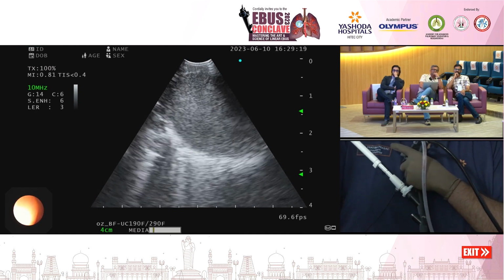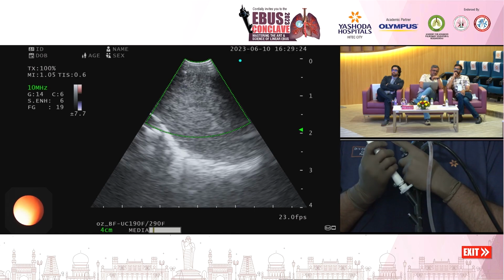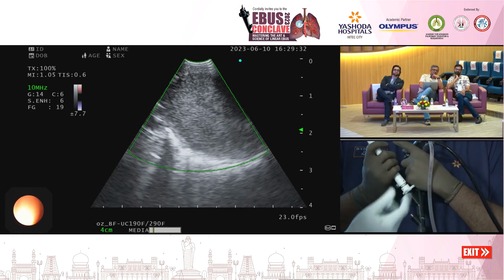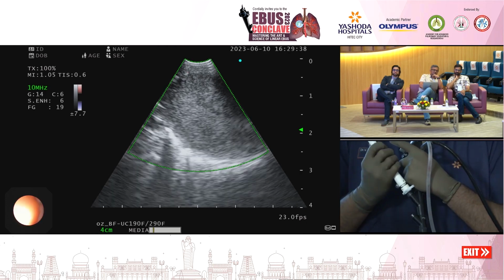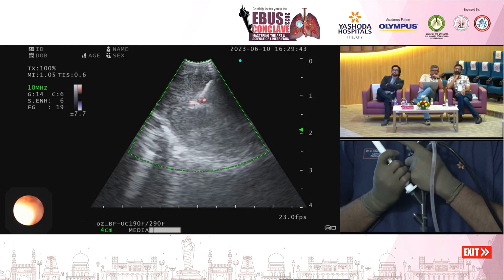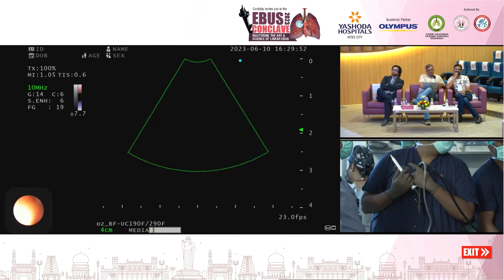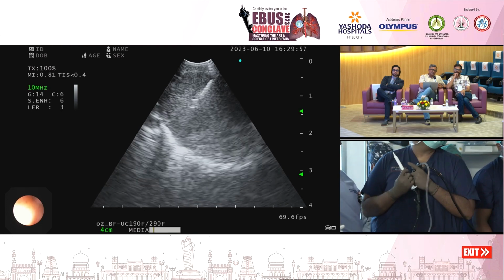Unlike the previous techniques which we have shown, which at least have a diagnostic implication, getting a biopsy will increase the yield over an aspiration, and doing an EUS may increase the diagnostic yield in staging EBUS. But all of these endoscopic advances, I would say, are extrapolated from gastro. Elastography also is not EBUS to begin with. It is for the pancreatic lesions and other lesions where they apparently have a role. In EBUS they have extrapolated it, but it has not translated to clinical benefit.